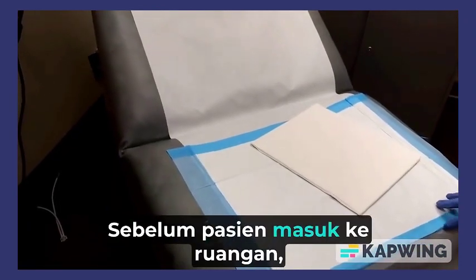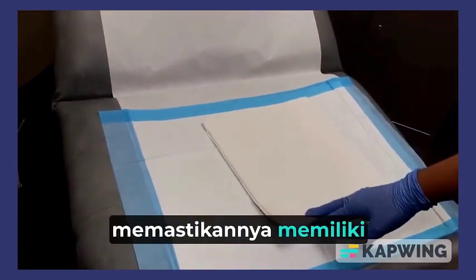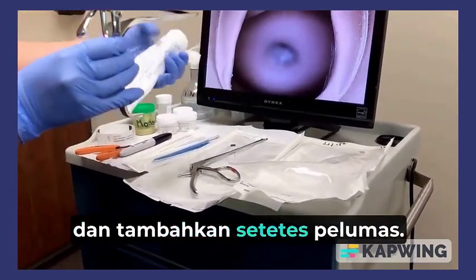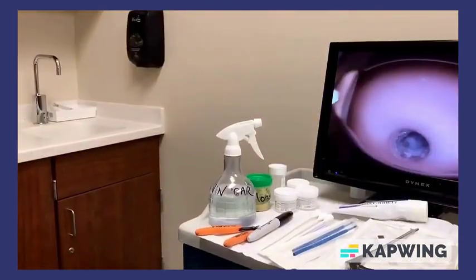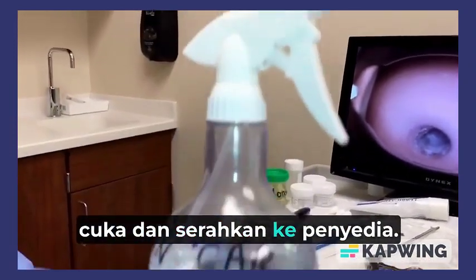Prior to the patient coming into the room, you want to make sure that you have a Chucks pad on the bed, and you also want to make sure you have the drape. First, the medical assistant will grab the metal speculum for the provider and add a drop of lubricant. After the provider has placed the speculum, the MA will grab the vinegar solution and hand it off to the provider.